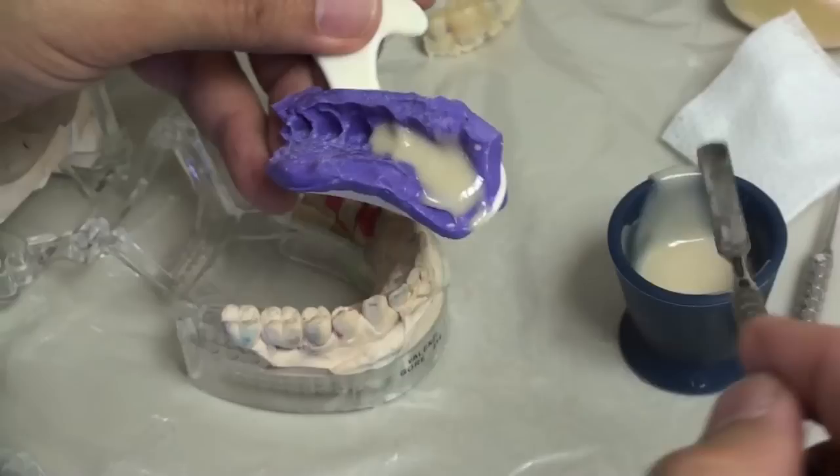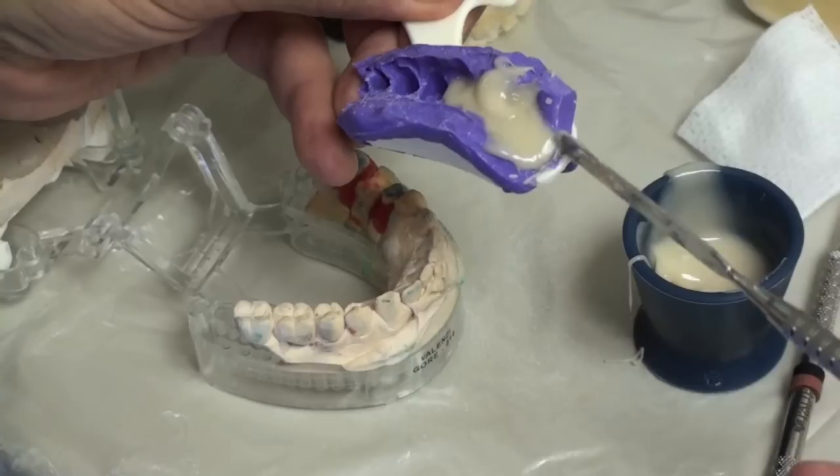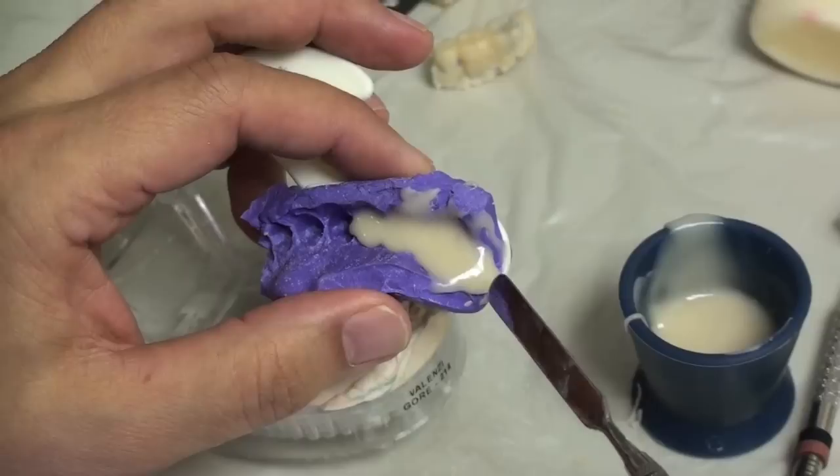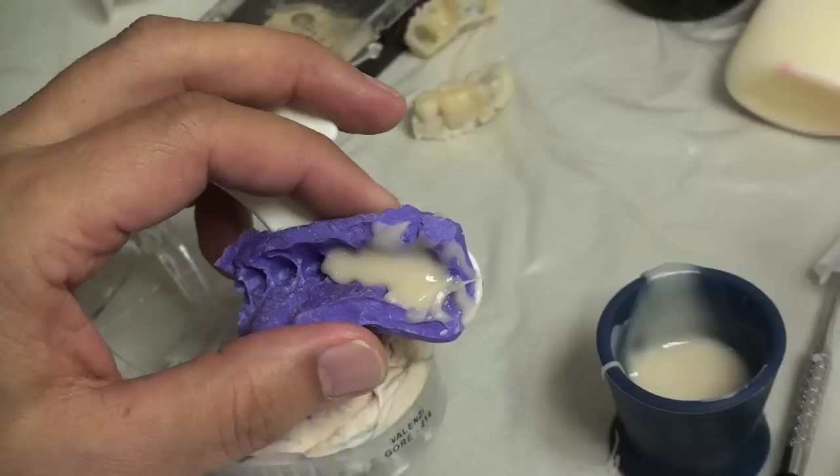Try to figure out about how much you're going to need depending upon how big that pontic space is. You might want to add a little bit more to make sure it totally covers that space. You don't have to put it in the patient's mouth immediately — I wanted it to be nice and runny so that it poured in here without any bubbles. I'm waiting for this to get a little doughier and lose its gloss so it doesn't run out so much.